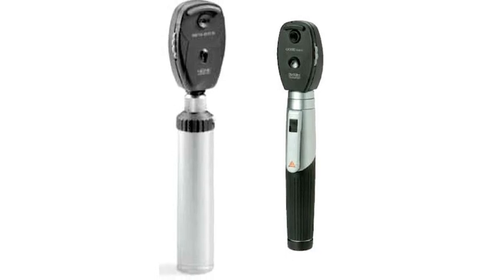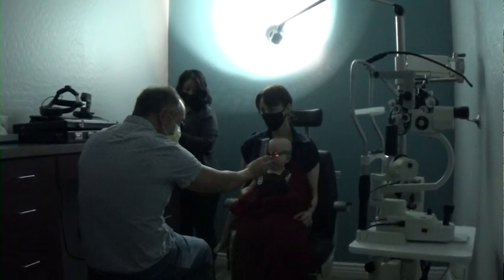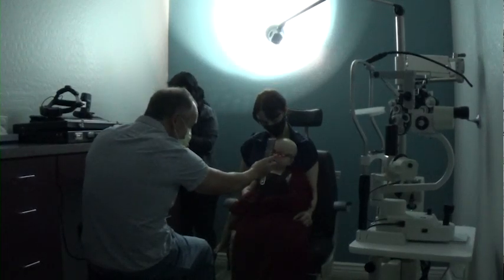They have to measure the eyes the old-fashioned way with a retinoscope. I've actually posted really good videos on that explaining what it is, but they take the lenses out manually, right? And what they're looking for, in simple terms, I'm not a doctor in ophthalmology, is how much light is shining in the back of the retina, and that's how they measure the acuity of the eyes.